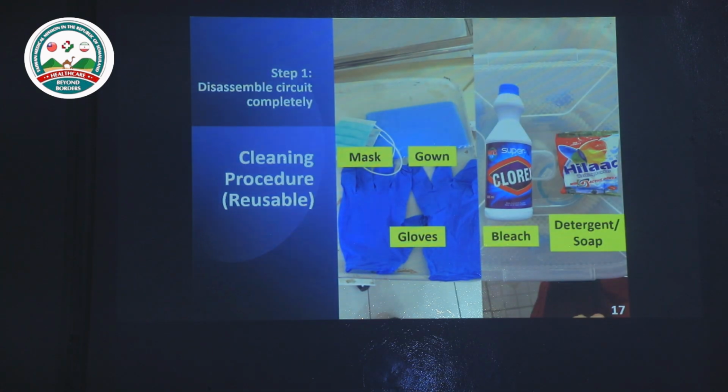Okay, so the following is our team's presentation on how to clean and how to disinfect the ventilator circuit in Somaliland. The first thing we need to do is to disassemble the circuit completely. So we disassemble the circuit and put it in a box. And remember to have a cover, because we need to prevent aerosol transmission from this ventilator circuit.